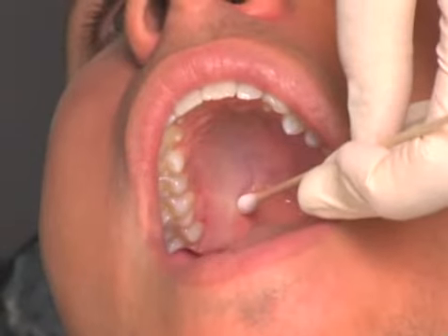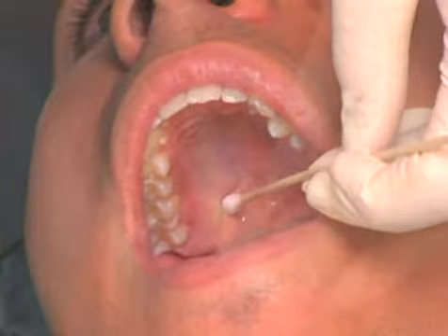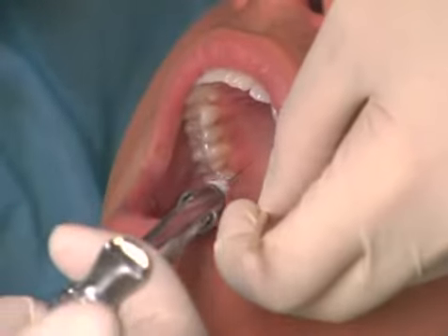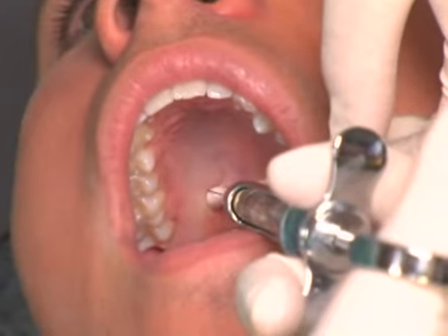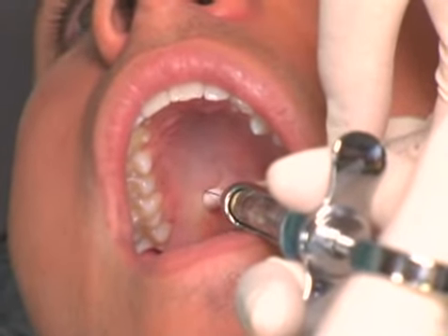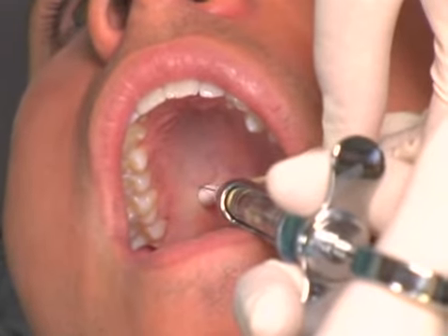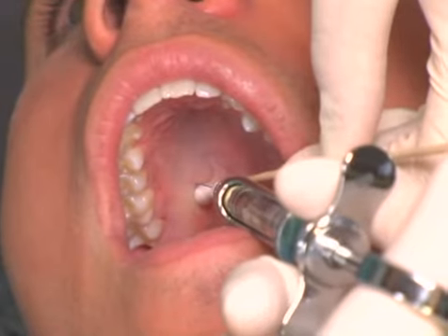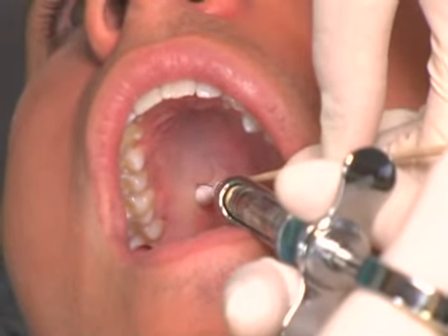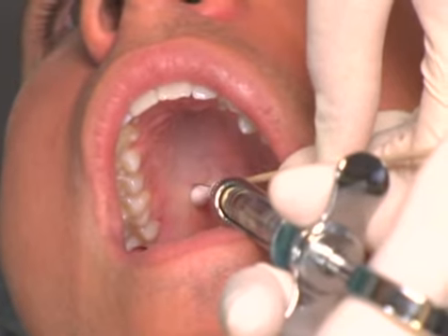A cotton swab is placed in the patient's mouth to palpate the greater palatine foramen. The needle is inserted into the soft tissues just anterior to the greater palatine foramen. As the needle is advanced through soft tissue, local anesthetic is deposited. On contacting bone and following negative aspiration, 1/4 to 1/3 of a cartridge of local anesthetic is deposited over 15 to 20 seconds.